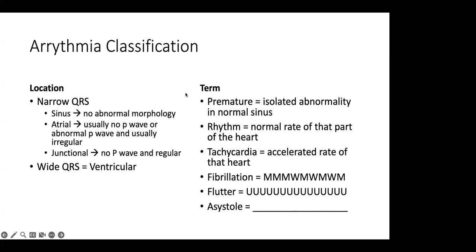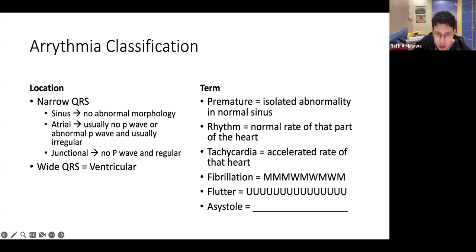Yes. Alhamdulillah. The question was, with Wolff-Parkinson-White, it's usually wide, narrow unless it's antidromic. Okay, that's a good point. So with Wolff-Parkinson-White, the whole antidromic, orthodromic, I know the slide you're referring to.